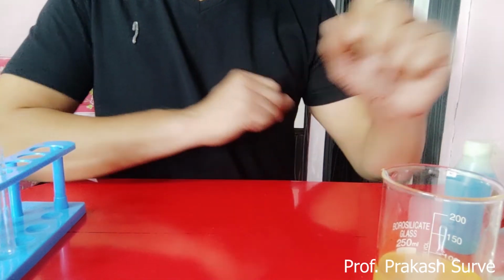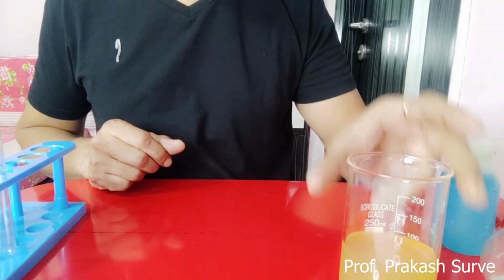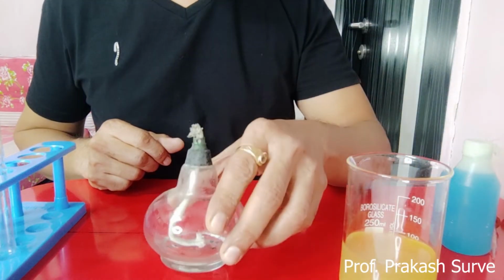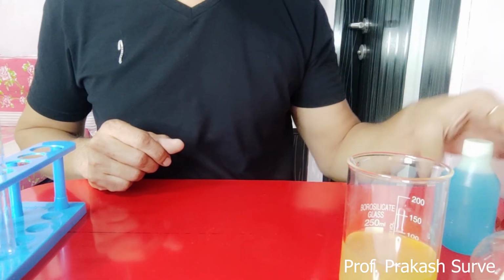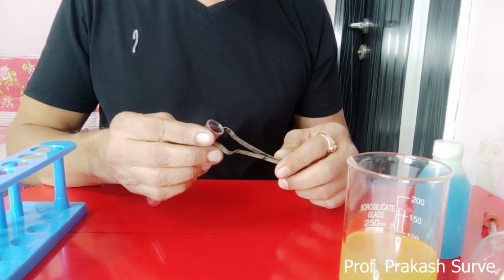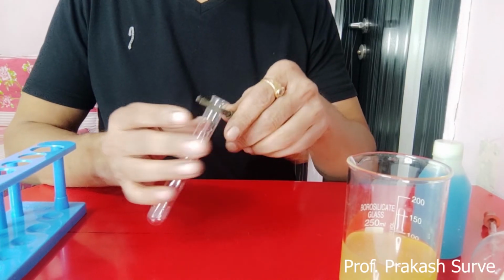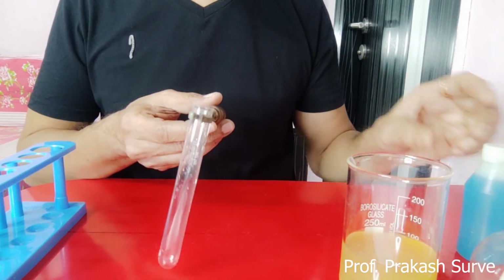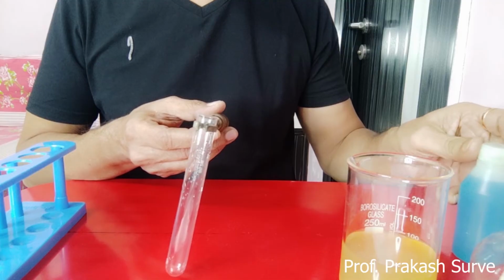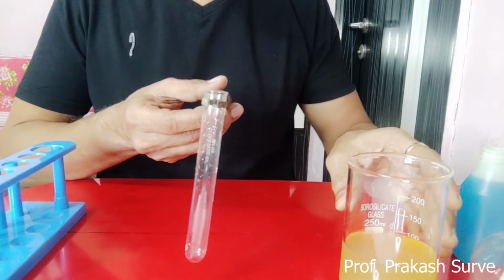Now we'll perform this test. We'll repeat again. We require the urine sample, the spirit lamp, the Benedict reagent, as well as the test tube and the test tube holder. So in this test tube, first I will take 2 ml of the urine sample and then we'll add 1 ml of the Benedict reagent.